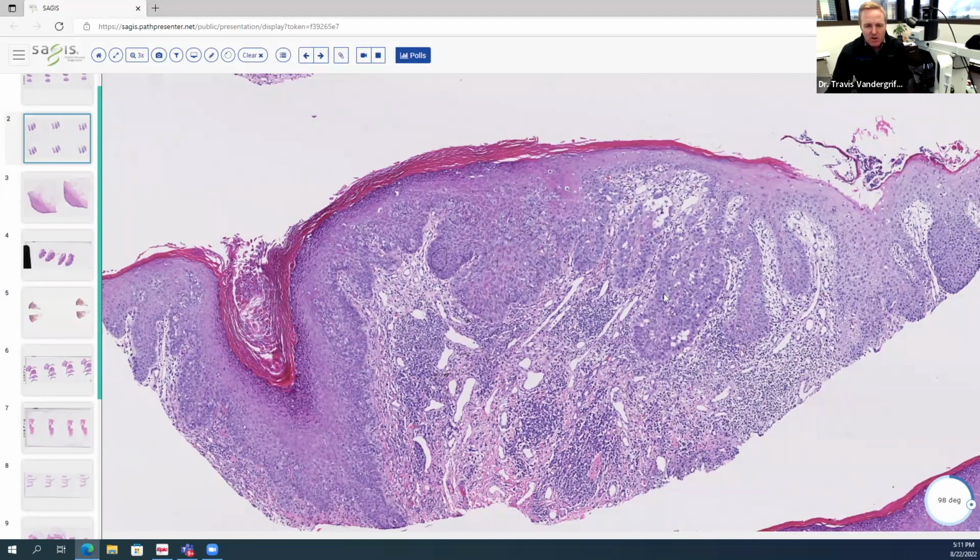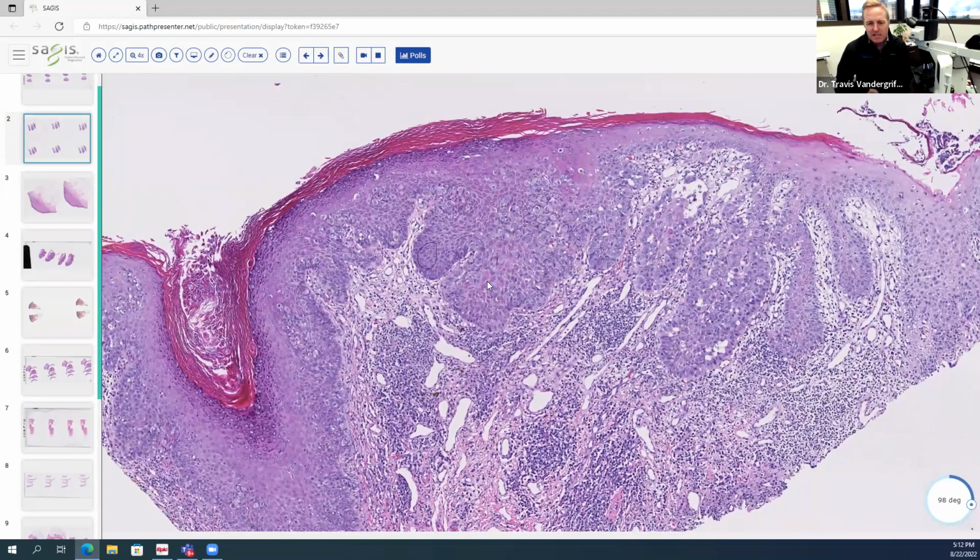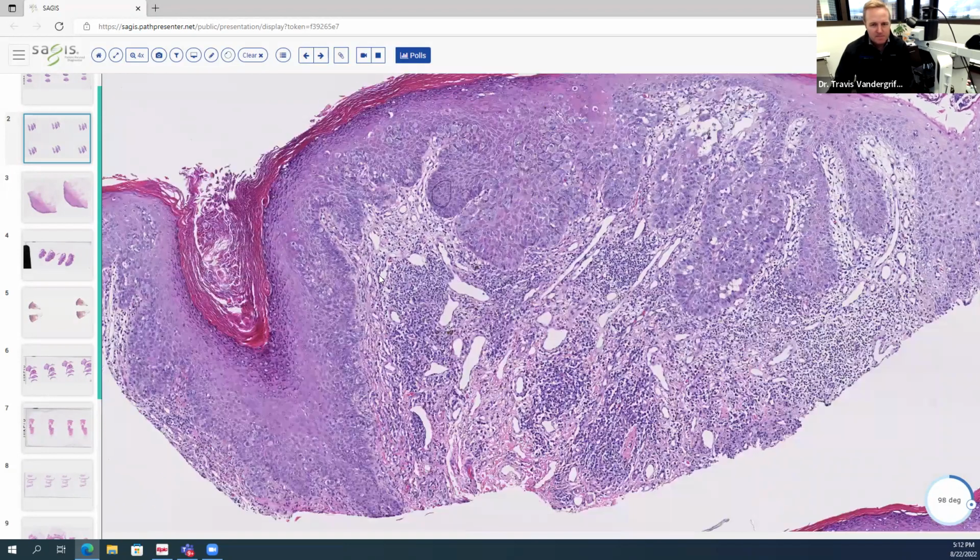And it requires some clinical workup with imaging to exclude that process. It may be, and in most cases it usually is, a skin cancer, which is an apocrine carcinoma in situ, but occasionally it can represent metastases into the epidermis from an underlying adenocarcinoma of the pelvis.